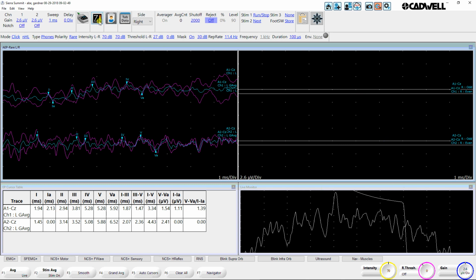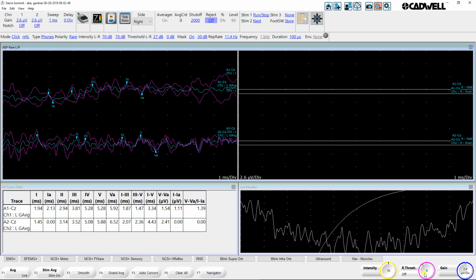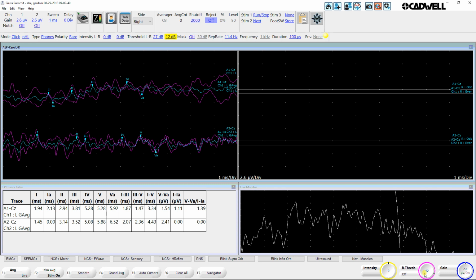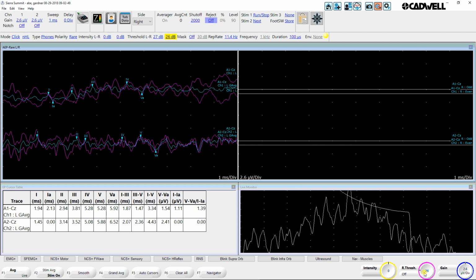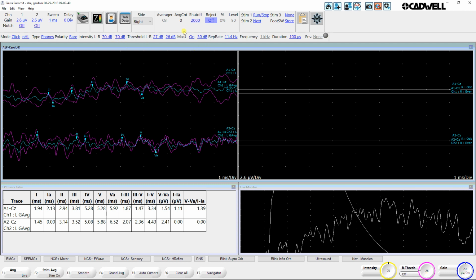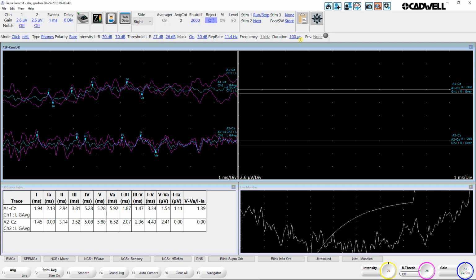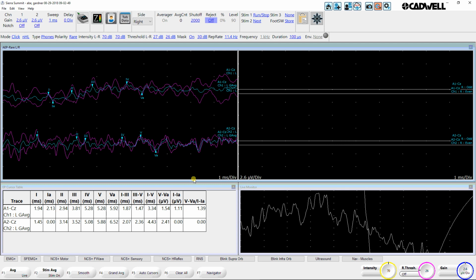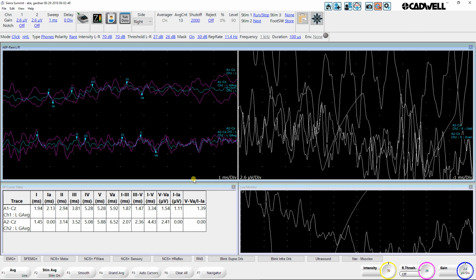First I'll check my impedance, check my montage setup, and then I'll start turning the pink knob to check the threshold. That zeroes out my intensity and my masking, so now my only intensity is the threshold intensity. Once I find the patient threshold, I push down the pink knob. That turns back on the intensity and the masking, and my threshold is now going to be added to the intensity level. I can adjust any settings as needed at this point, and then I'm going to push run stop on the base unit, the run stop button, to start acquiring data.